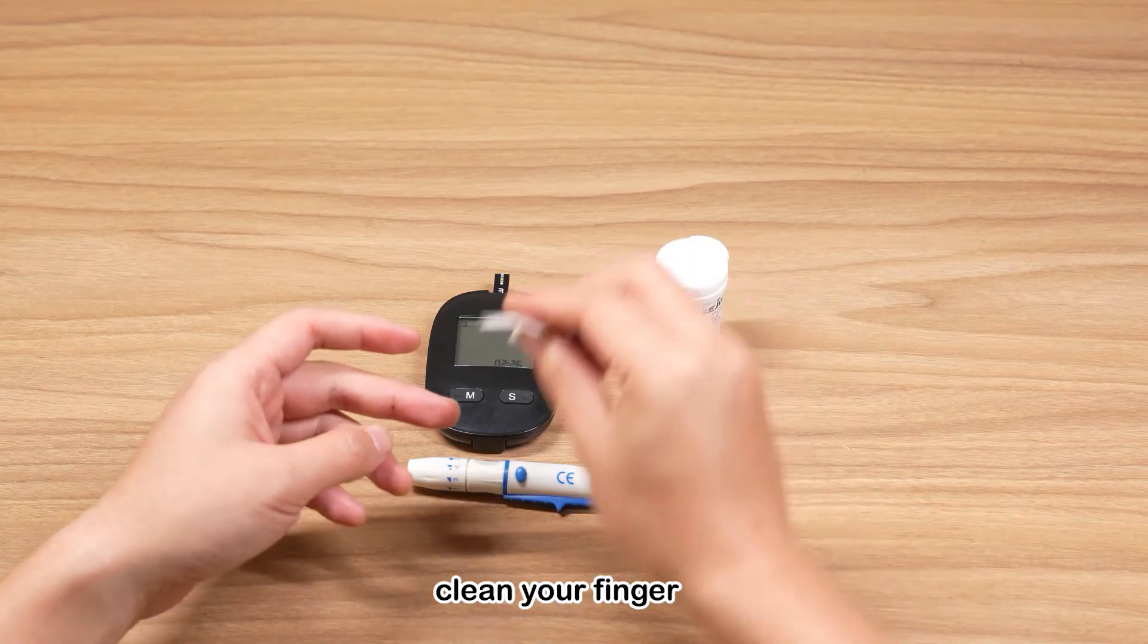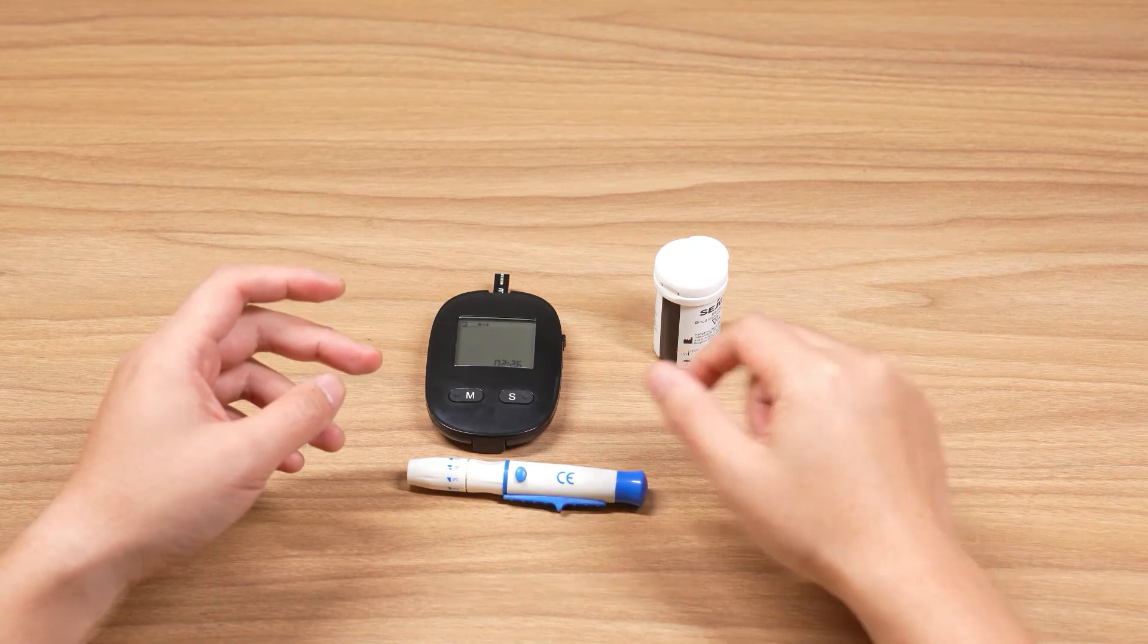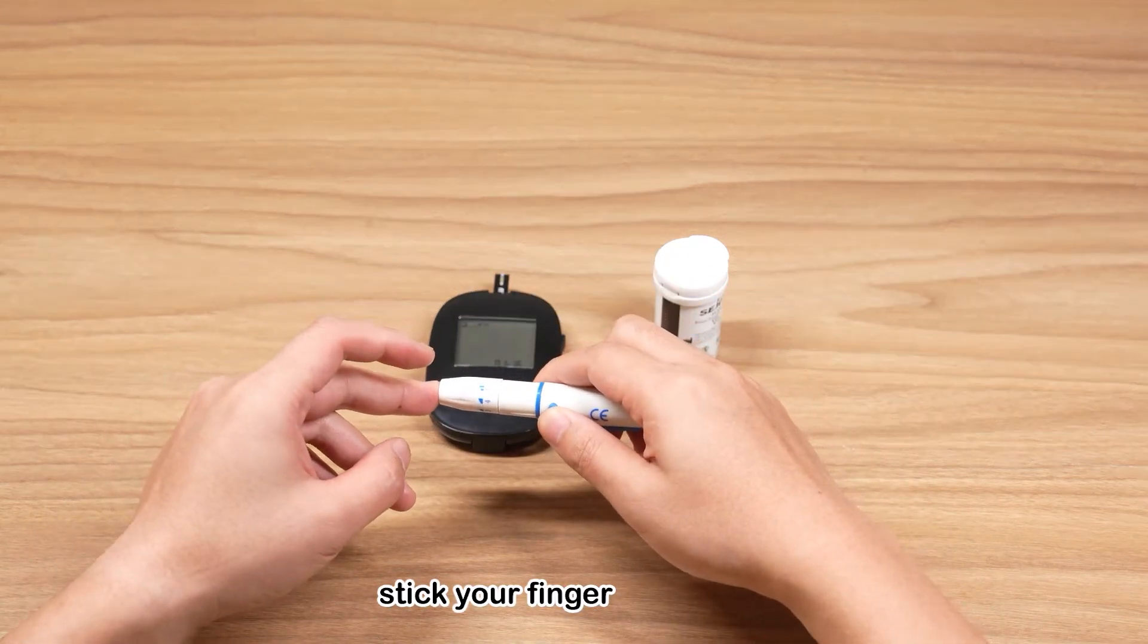Clean with alcohol wipe and wait until it dries. Hold the lancing device firmly against the side of your finger and press the release button.